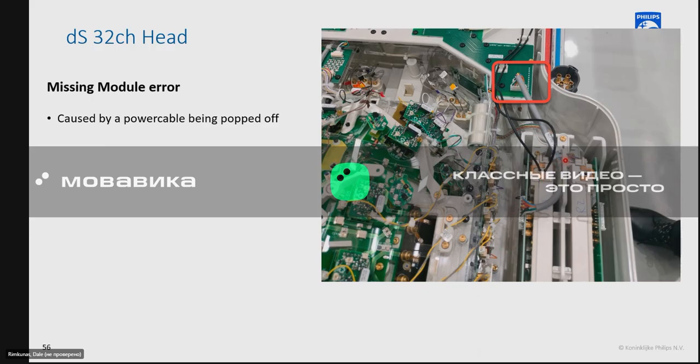Didn't require any AFRUs or parts. Required a Torx 10 to open the back of that. Takes maybe 5 minutes to get inside there and just see something obvious. So many of these fixes are just obvious. You'll see them in there.